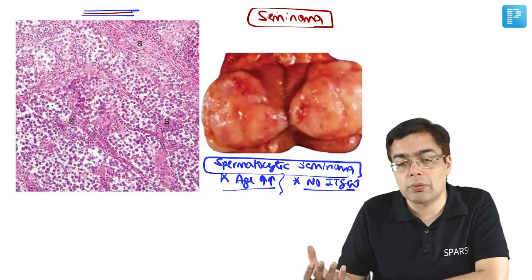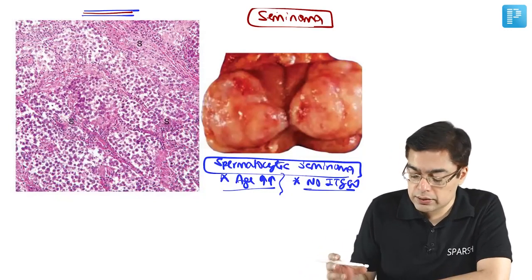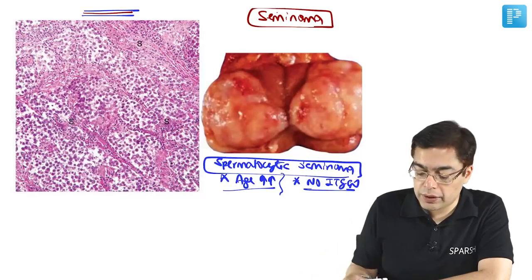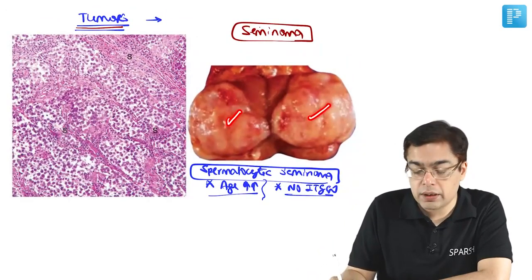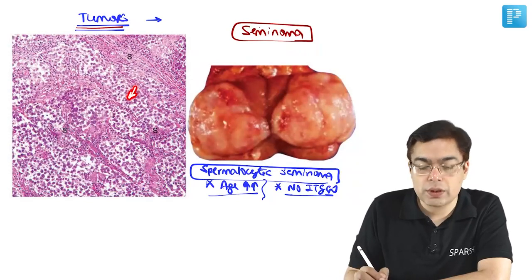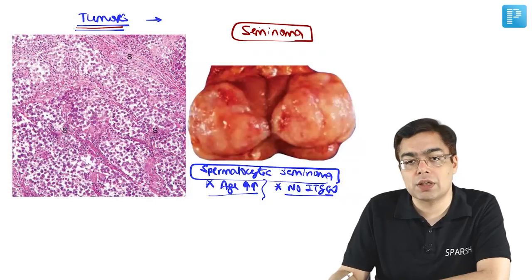So if you are able to recall about the concept of the large cells, the middle cells, and the spireme chromatin that I told you, that would be really good. But at least for the basic, be familiar with the age group of a seminoma, appearance, and the presence of cells with clear looking cytoplasm, watery cytoplasm, and lymphocytic infiltration in the fibrous septa.